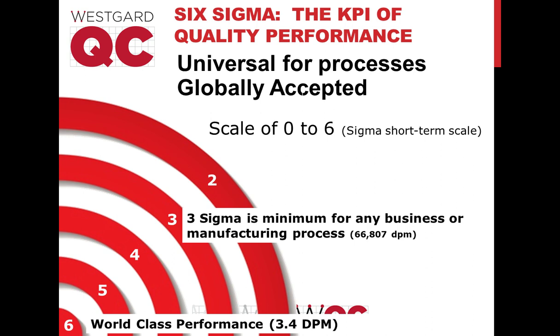How should my QC approach change with the recent waived instrumentation for CBC, for example, full blood count, and FBC analysis soon to be on the IVD market?